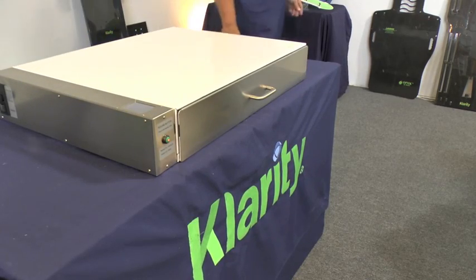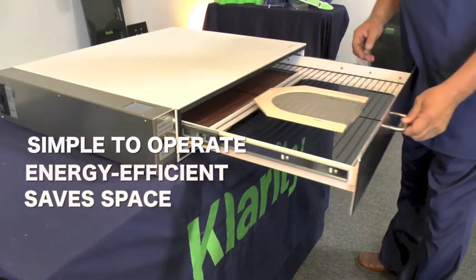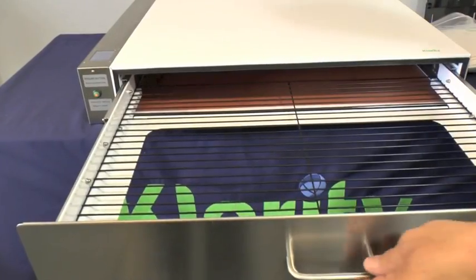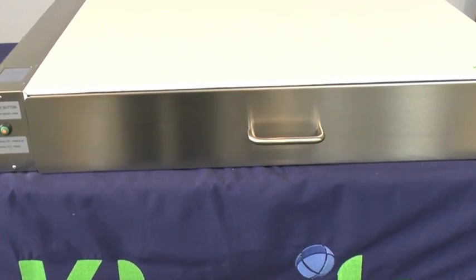No water also means you'll minimize the possibility of staph and bacterial infections. That's not the only advantage of the Clarity Oven — it's simple to operate, energy efficient, and saves space. Simply turn it on for a quick warm-up, place the mask inside for a few minutes, and you're ready to go. It also has a standby mode and will shut itself off after two hours of non-use.